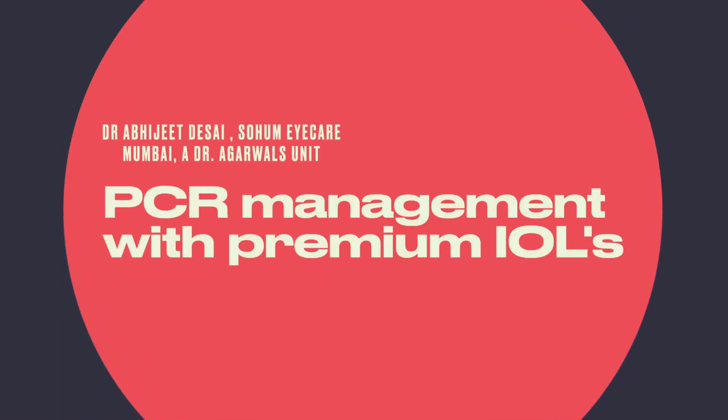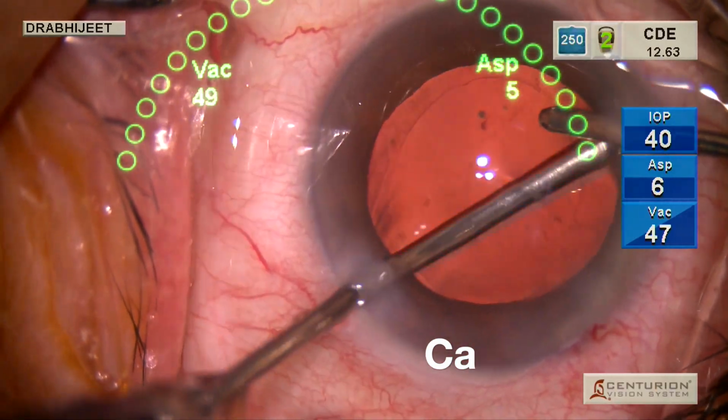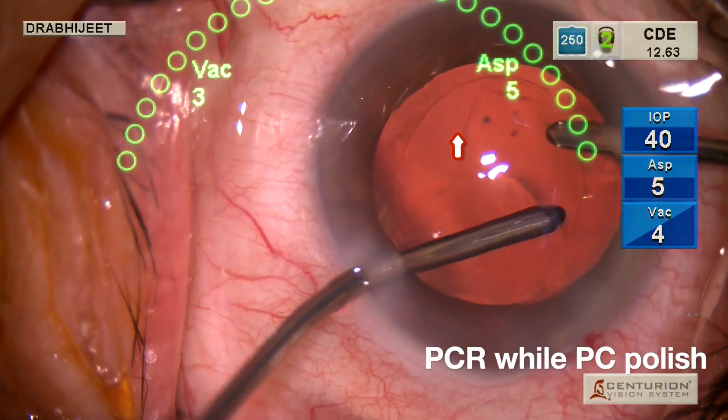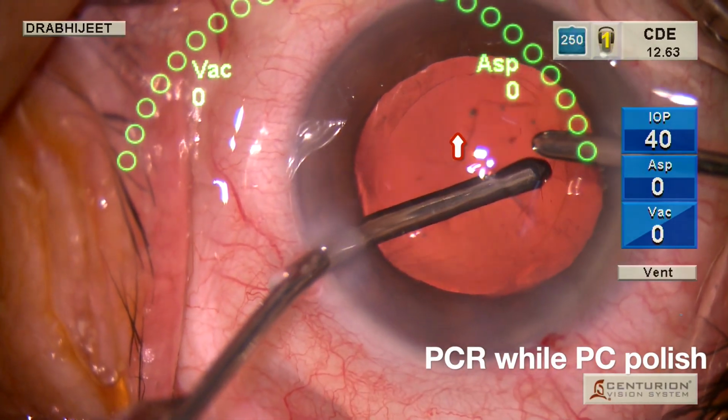We are going to be talking about PCR management with premium IOLs. This is a case-based scenario. Let's talk about the first case in which I am doing an irrigation aspiration and we get a PCR out here.